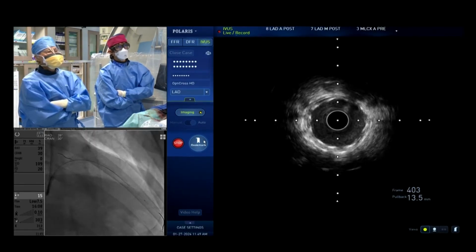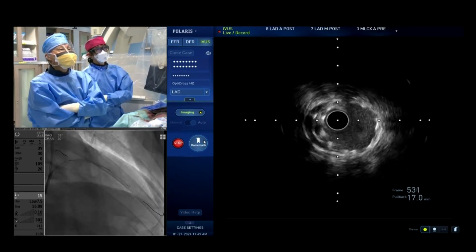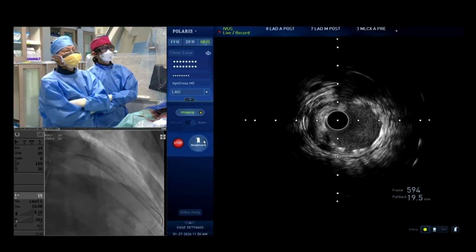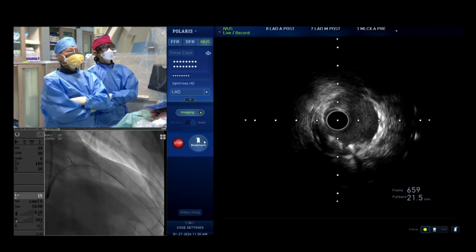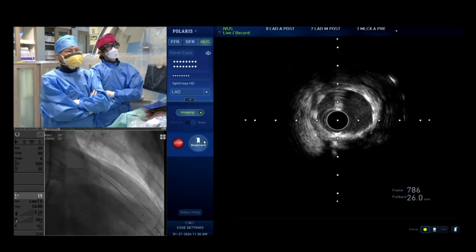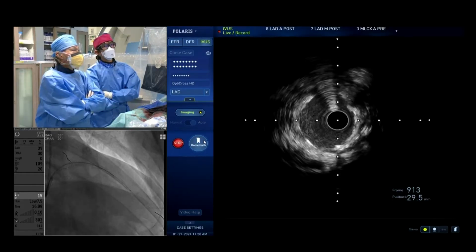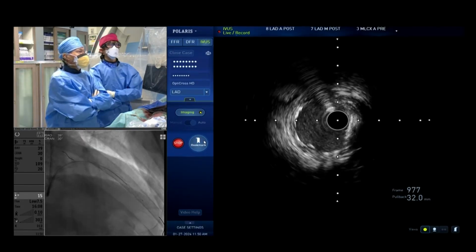You think so? I thought it's just plaque at the bottom end. It looks like there's some issue there. We can analyze again after the pullback. Yeah, okay. There is some plaque beyond the stent. Yes, all over. So we just wanted to land where there is the least plaque.